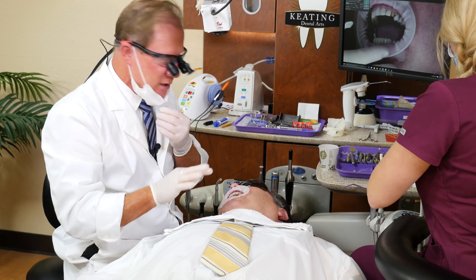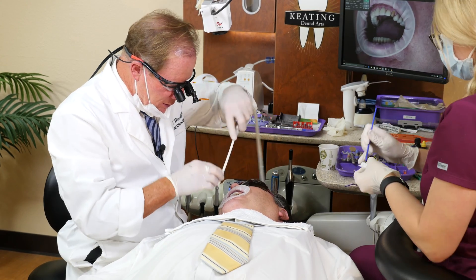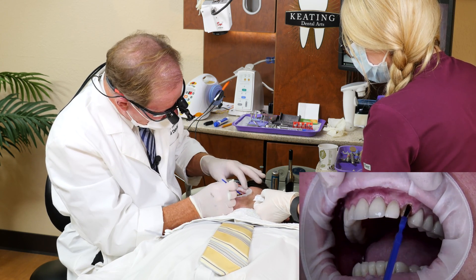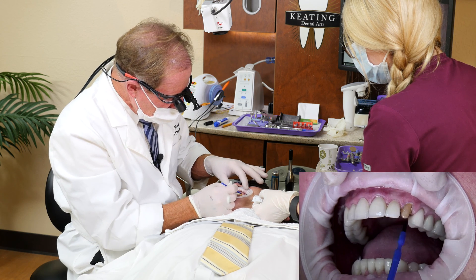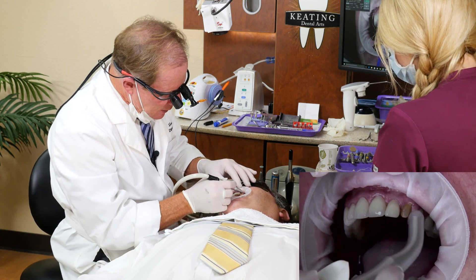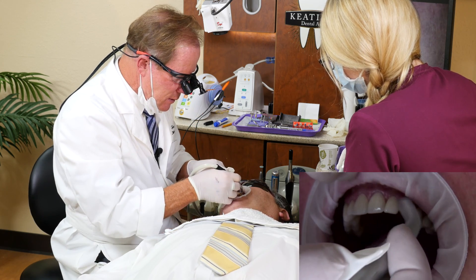Now we're going to go ahead and mix our primer — this is All Bond 3. It's an AB primer, so it's dual cure as well as light cure. This is a 4th generation dentinal primer, so multiple layers of primer. It has a self-limiting film thickness of less than 10 microns, so I'm not worried about this keeping my crown from seating. You'll smell a little bit of an acetone-like smell. We're going to use moisture-free air — this is an alcohol-based system, so we need to dissipate the alcohol and allow it to evaporate. This is an ADEC warm air tooth dryer, which gives us dehumidified and oil-free air.